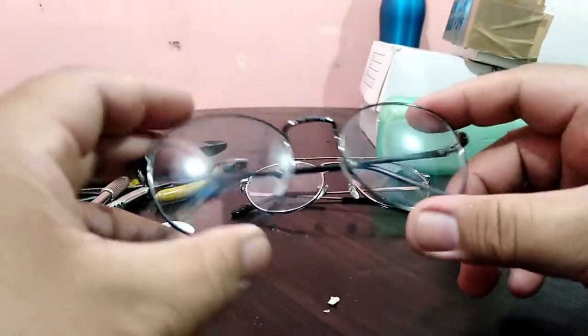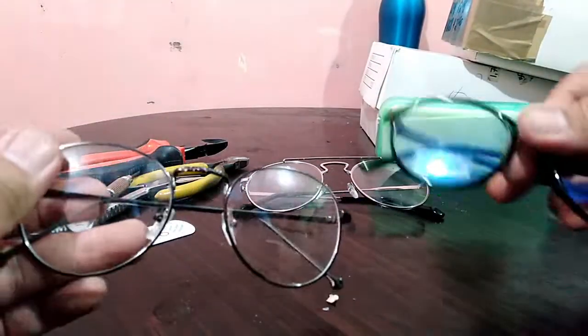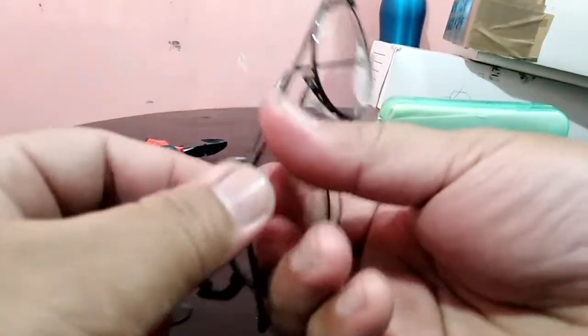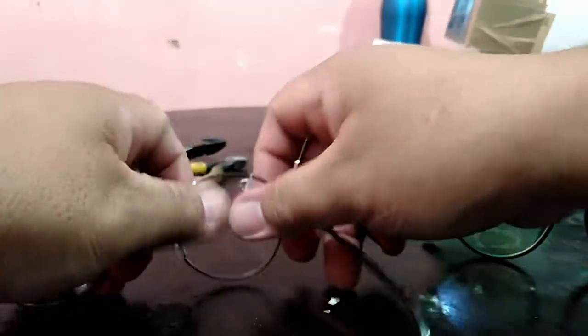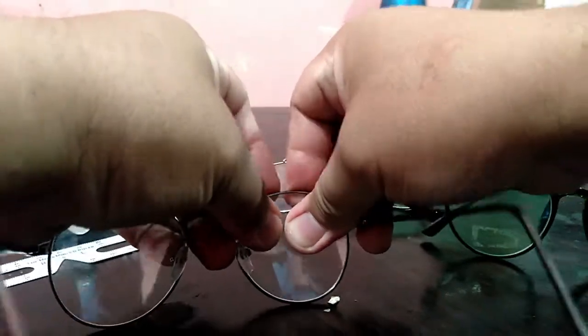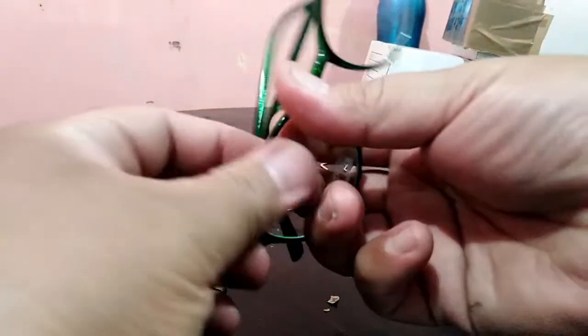Same thing also for round frames. For example, if you have a lens you need to transfer but don't have the same frame available, you can look for the same shape — round shape and same material like plastic. Remove your old lens, look at the back, do your two-point push, hold on top of the frame and push to snap it out.